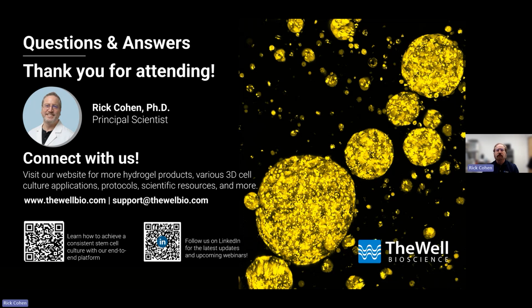So that's a huge challenge for us. And what you're seeing now is kind of the entryway into that. If you're interested in scaling up into more of a liquid-based assay, we do have protocols for it where we dilute the static system a few times with media and some other components to help survive the shear force of these bioreactors. So yes, our media is compatible, the hydrogel is compatible, and the big question mark is: is your bioreactor safe for iPS cells? And if it is, and you know how to use it, then our system will suffice for it. Thank you so much for the answer.